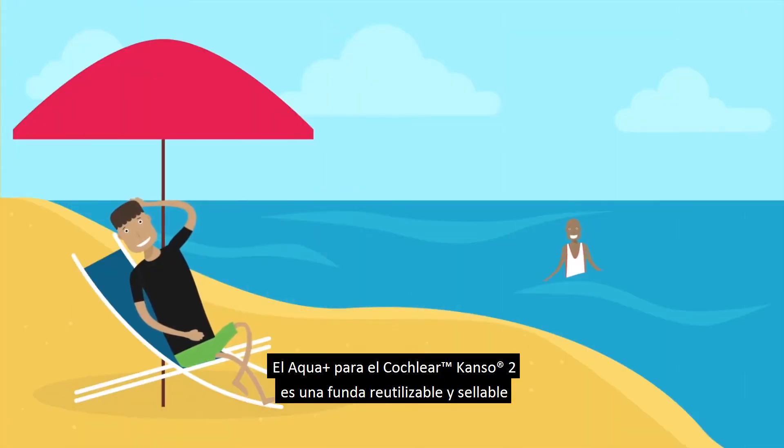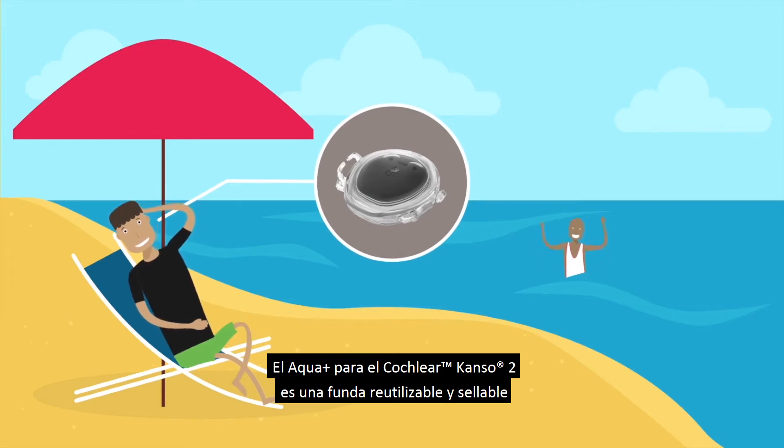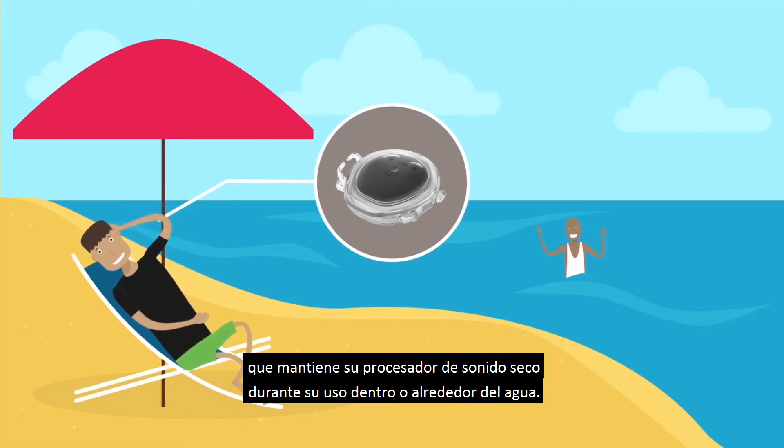The Cochlear Canso 2 Aqua Plus is a reusable sealable cover that keeps your sound processor dry during use in or around water.